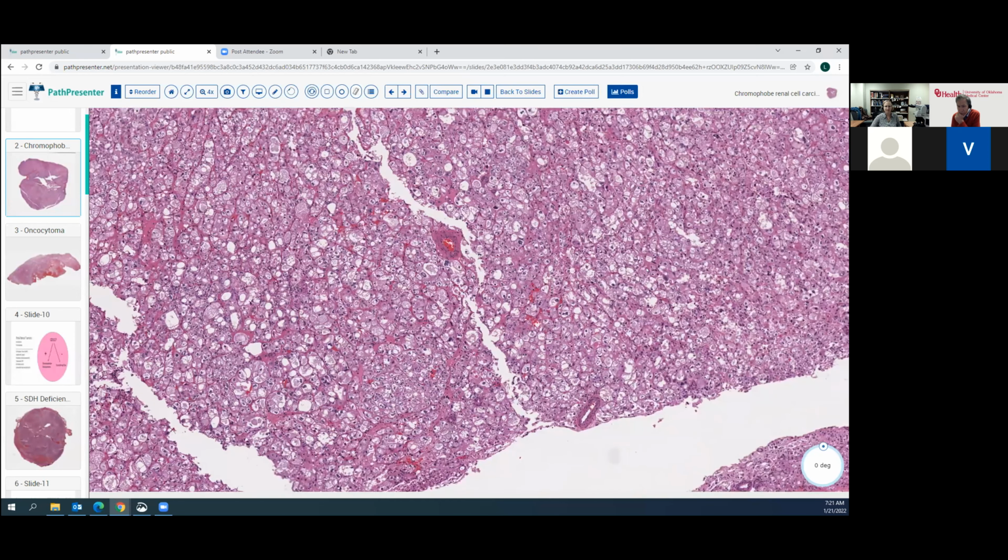Okay, so this tumor, you can tell right away that we're not in kidney. We're looking at a metastasis. So we already know that this is a very high grade tumor. It's already metastasized. We're not even looking at kidney anymore. Okay, so let's go in high power. Again, very pink eosinophilic cells, voluminous amounts of cytoplasm. As we keep going higher power, we've got these fibrovascular cores lined by these malignant cells that are very pleomorphic, with very prominent nucleoli.